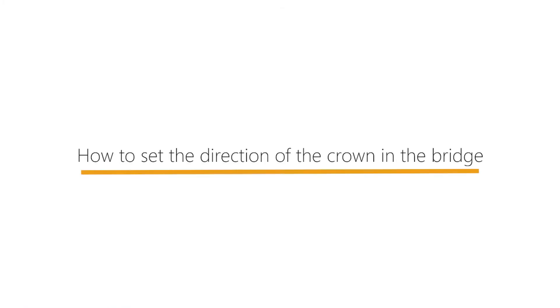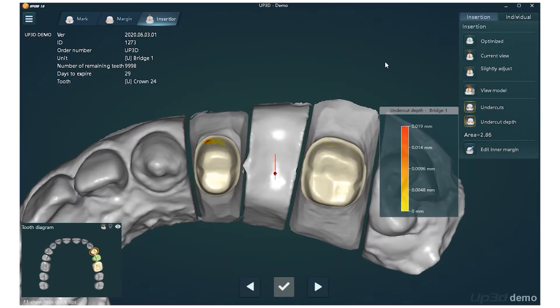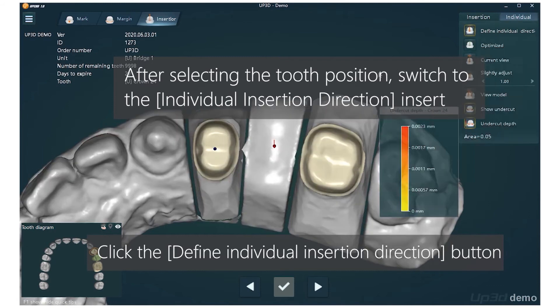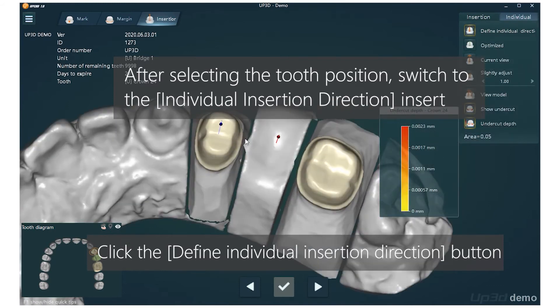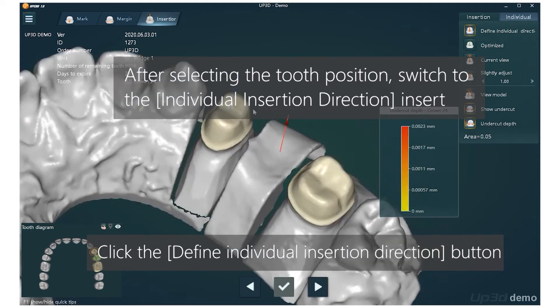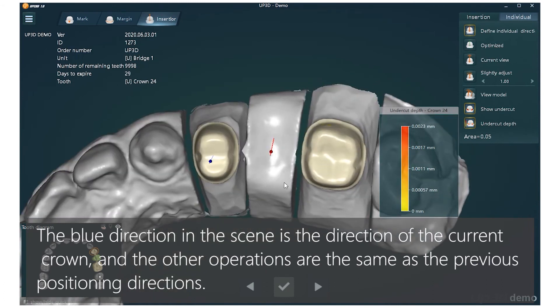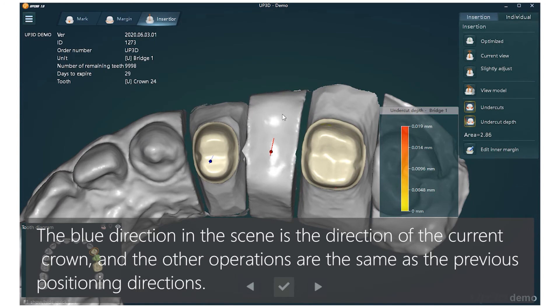How to set the direction of the crown in the bridge? After selecting the tooth position, switch to the Individual Insertion Direction. Click the Define Individual Insertion Direction button. The blue direction in the scene is the direction of the current crown, and the other operations are the same as the previous positioning directions.